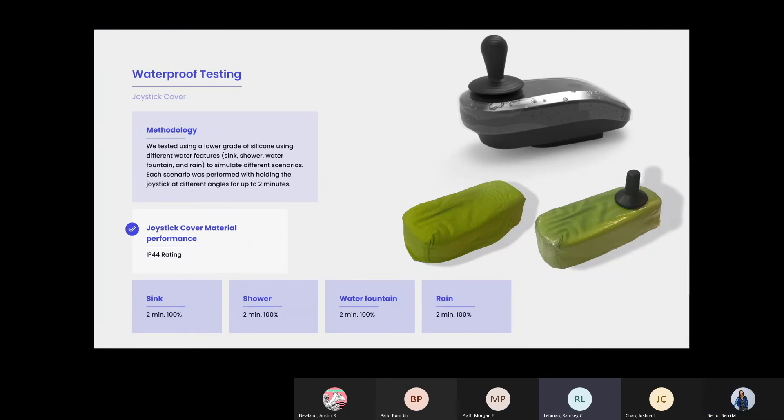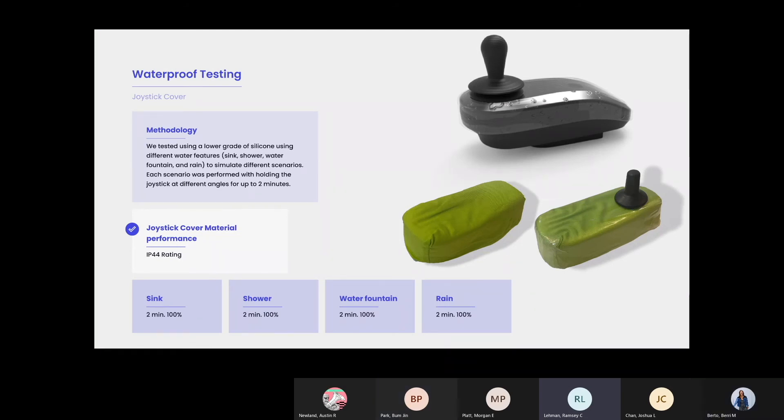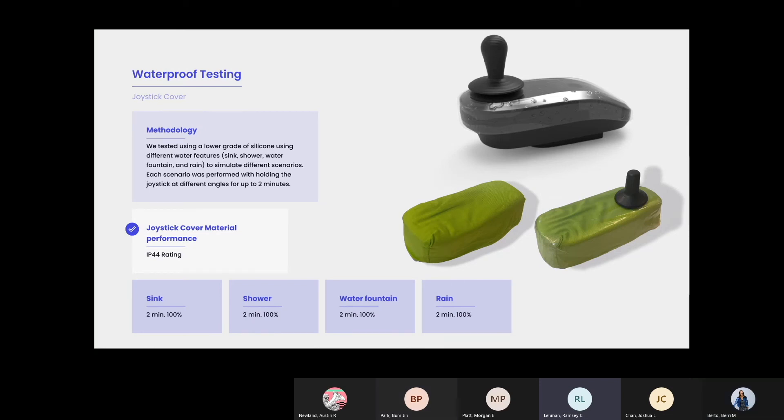We conducted a waterproof test. We tested using a lower grade of silicone using different water features to simulate different scenarios. Each scenario was performed with holding the joystick at different angles for up to two minutes. The joystick cover material performance succeeded in IP44 rating.